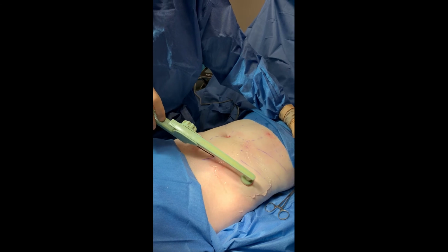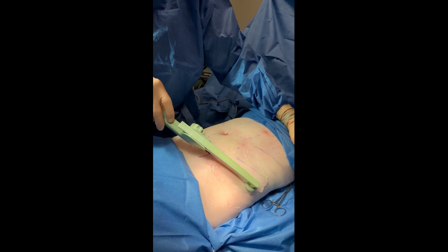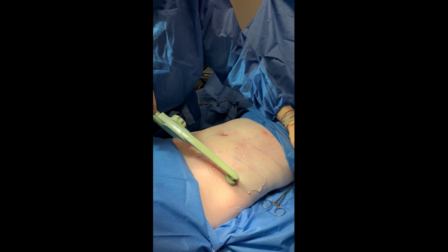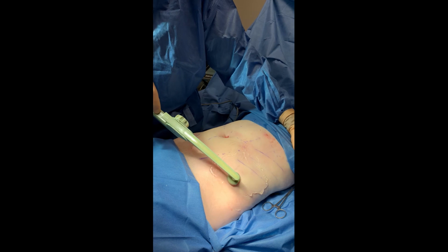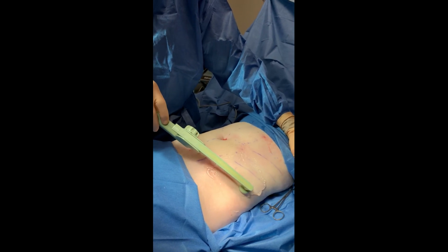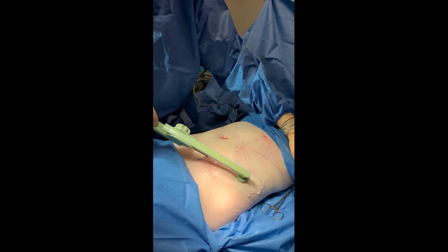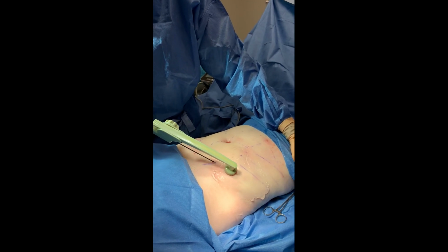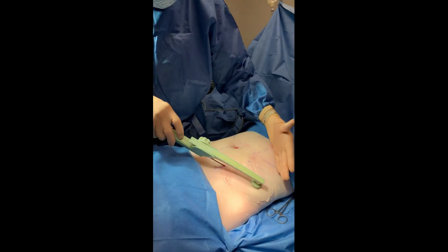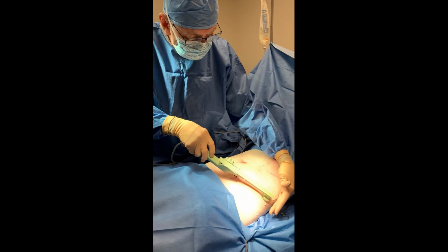And what you're hearing is the monitoring of what we're doing. And what it's doing is causing some destruction of the fat and tightening the fibers and the skin to result in a tightened and contracted skin. So we're not only removing some fat, but we're also going to be tightening the skin of this area.